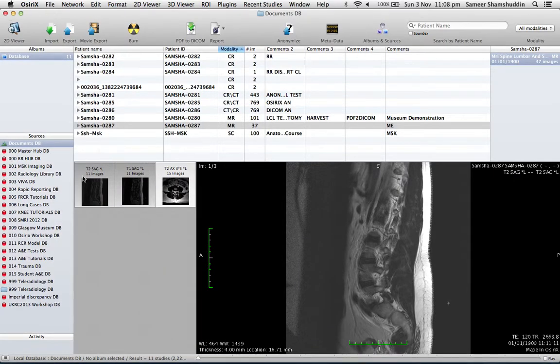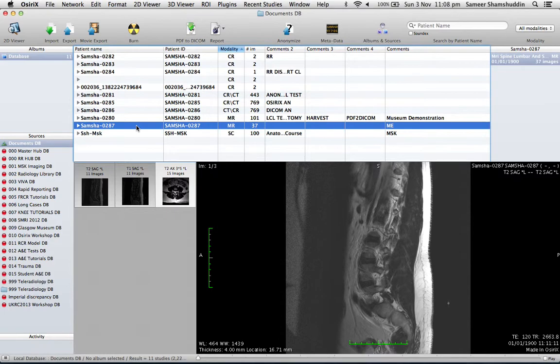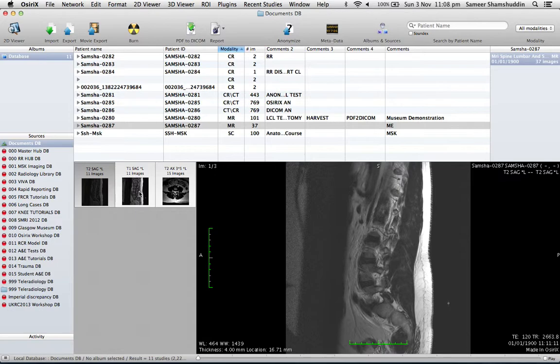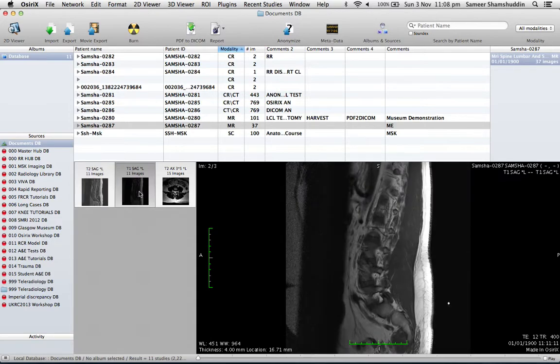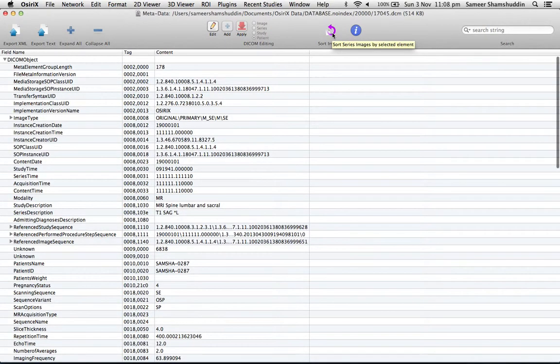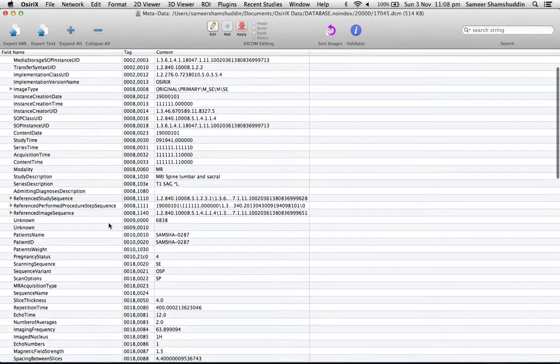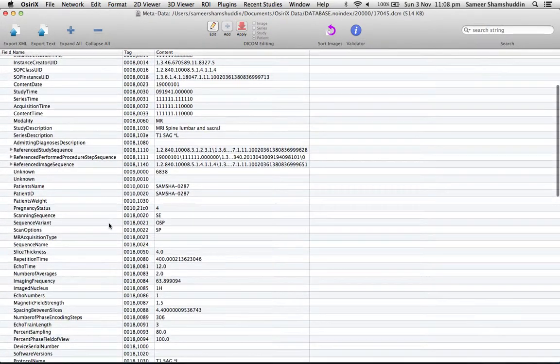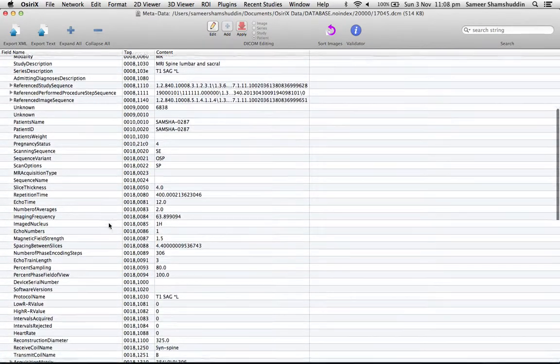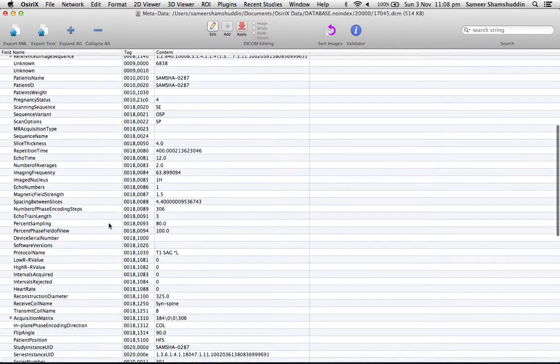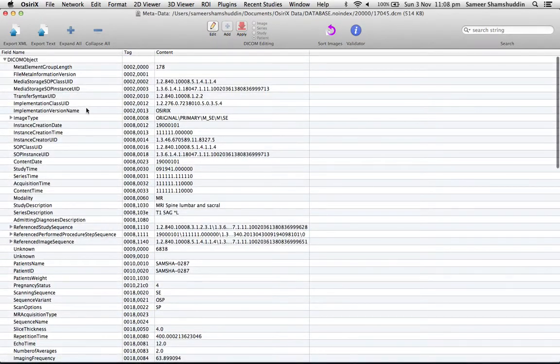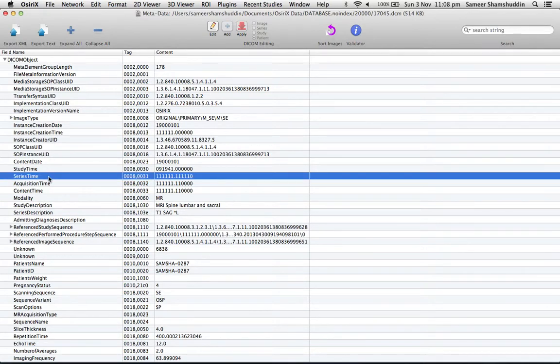Once you have changed that, you should be able to edit the metadata. So let's pick up one of the series. Now, the T2 sagittal needs to be in second place, so let's edit the T1 sagittal. Highlight the T1 sagittal and click Metadata, and scroll down to find series number in the metadata tag.